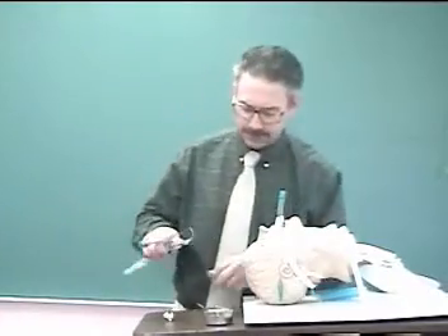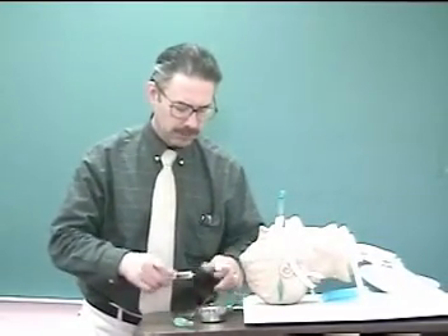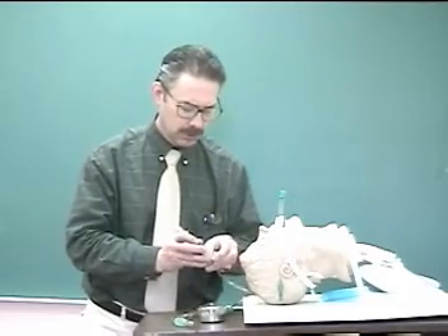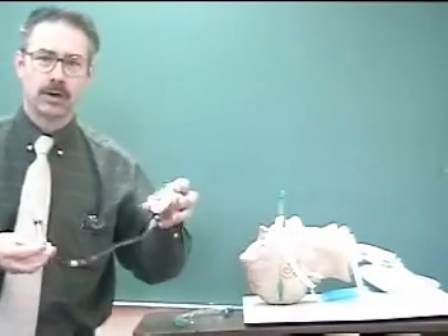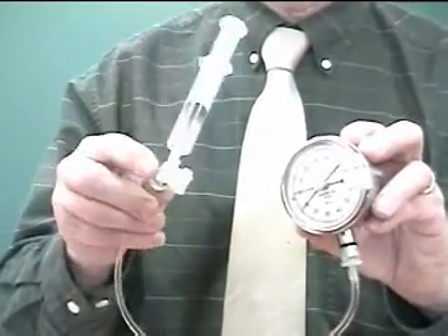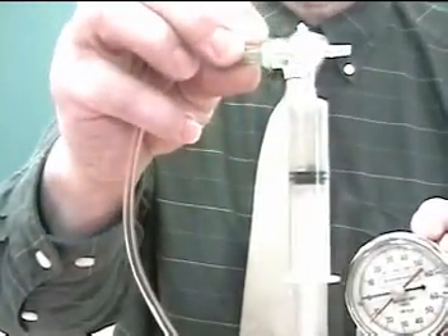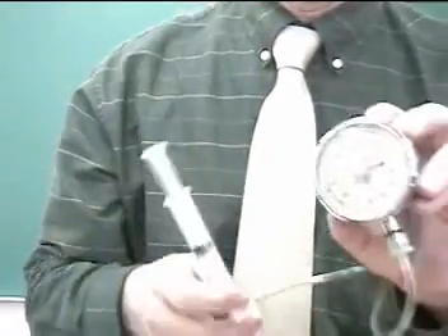First off, we have to have a cuff manometer. You've seen a close-up of this in the lesson. This is nothing more than a manometer gauge, a syringe, and a one-way valve. This one-way valve is called a stopcock.